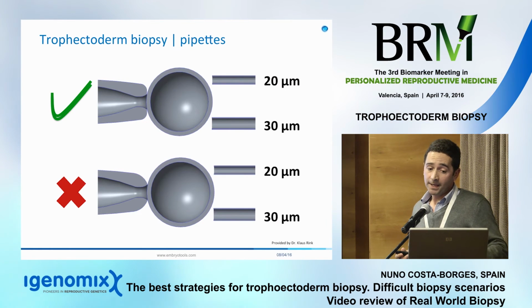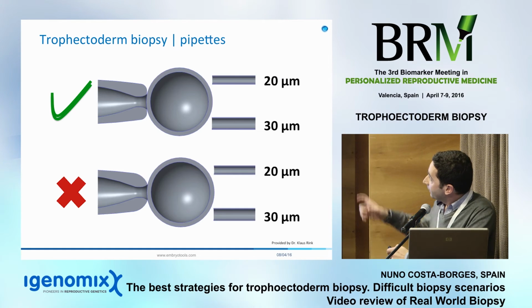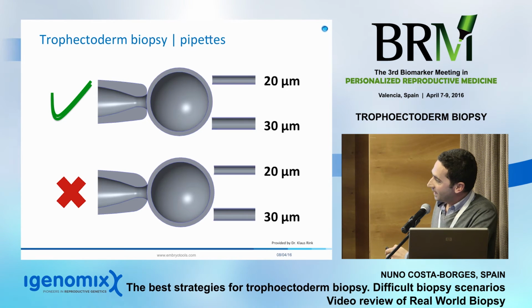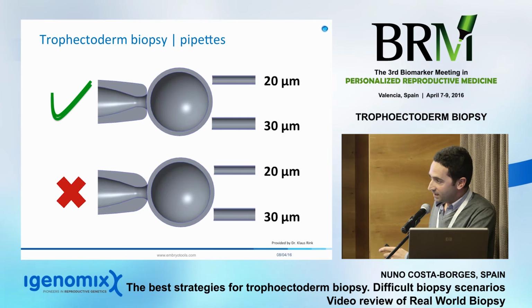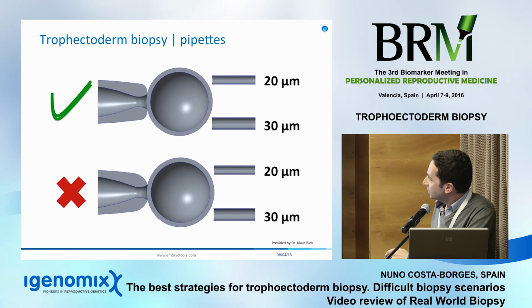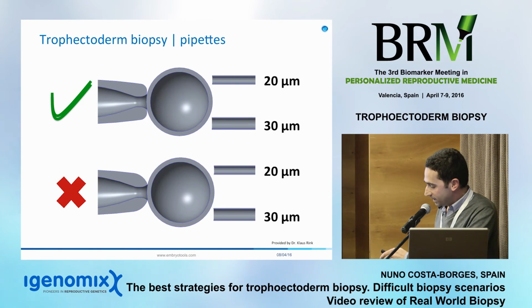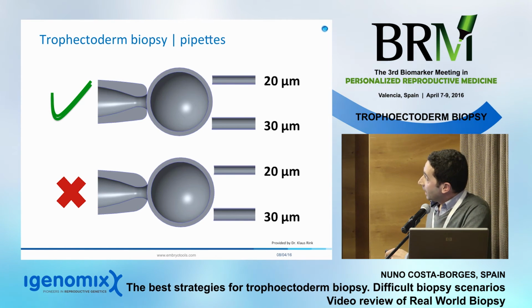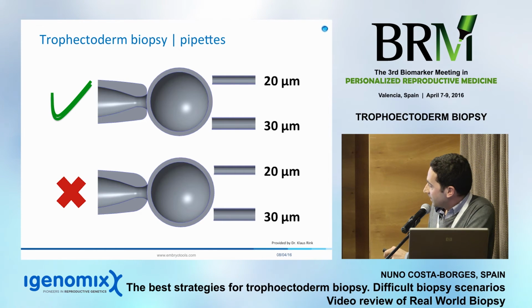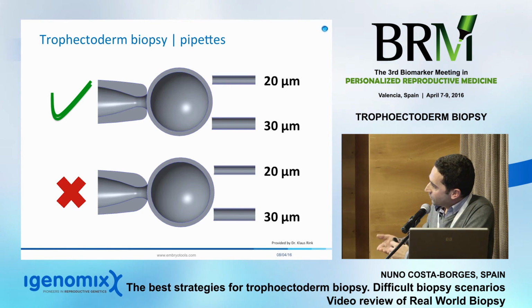And what is the ideal size of the pipettes? We normally have different ranges. We normally have stored from 20 to 30, and then depending on the degree of expansion of the blastocyst and how many cells we see or calculate there are outside of the zona, we decide which needle we're going to use. It's also important for the flicking method that the holding pipette is not rounded like in this case. It's a little bit more, how do you say? Flat, yes. So the movement is easier, and it's easier to know exactly that we are in the right focal plane. Okay.